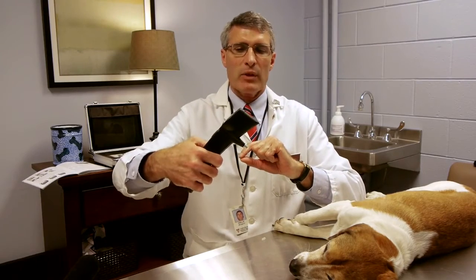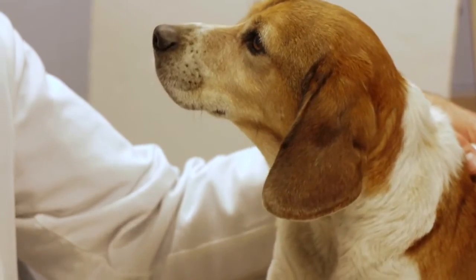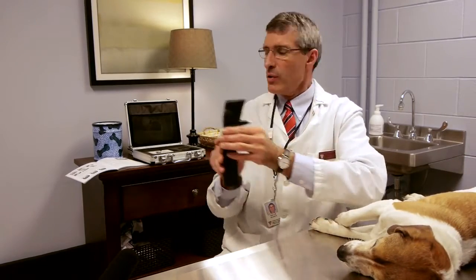Now it will not fall out of the instrument and it's ready to go. You do not need topical anesthetic for this instrument. Basically, you're going to have the animal sit up for you. We're going to use Prince here, my own beagle.